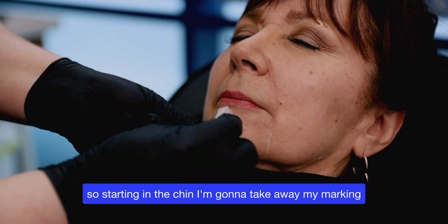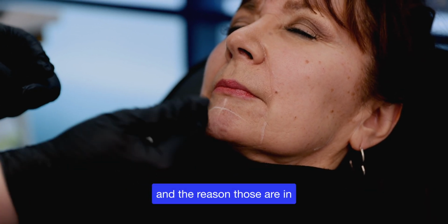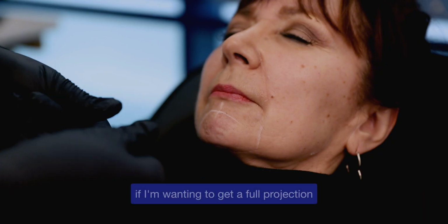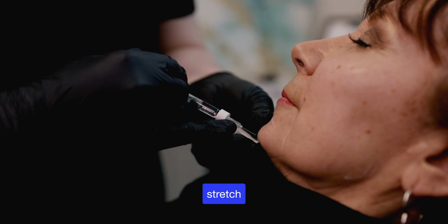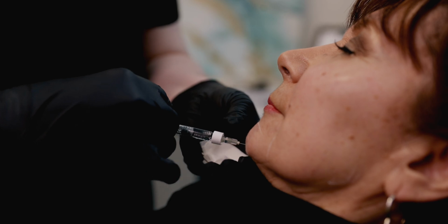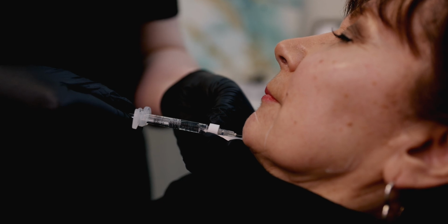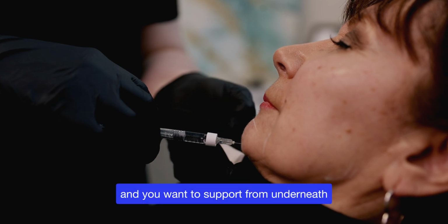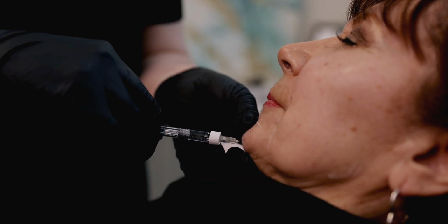So starting in the chin, I'm going to take away my marking, but leaving those top markings in. And the reason those are in is so that I can get a very dead central injection point. I can also fill in either side if I'm wanting to get a full projection. Stretch, sharp scratch. Doing okay? And aspirate. And you want to support from underneath and pinch on top. And I'm going to push.